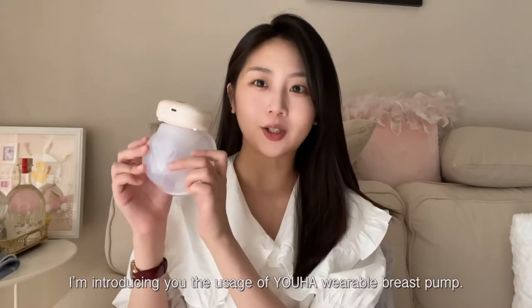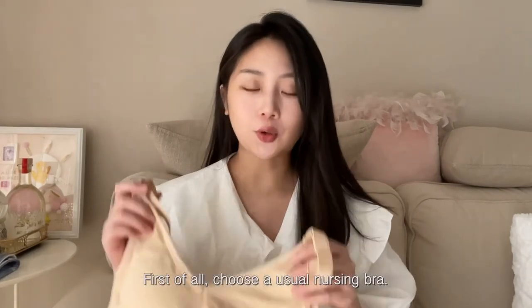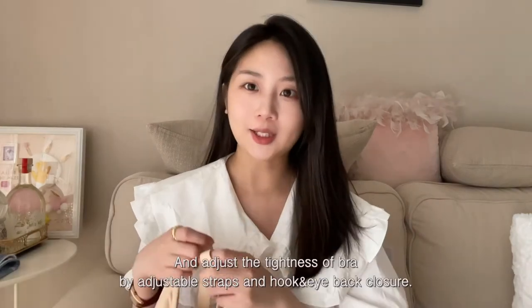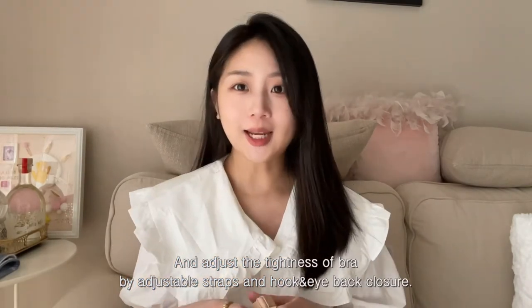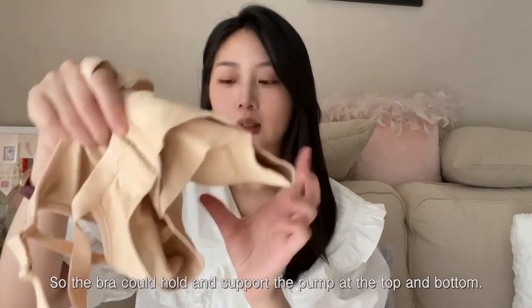I'm introducing you the usage of Yu-Ha wearable breast pump. First of all, choose a usual nursing bra, and adjust the tightness of bra by adjustable straps and hook and eye back closure, so the bra could hold and support the pump at the top and bottom.